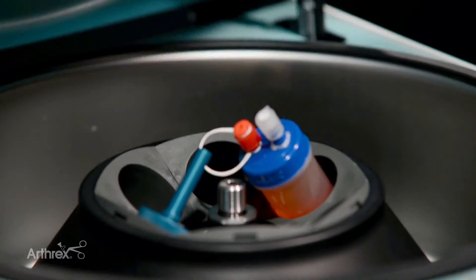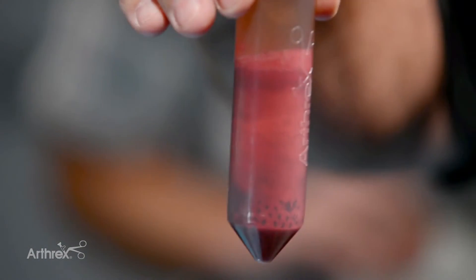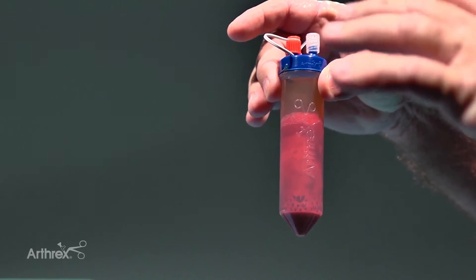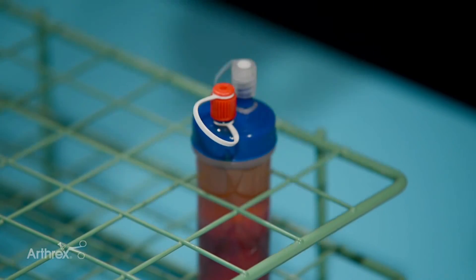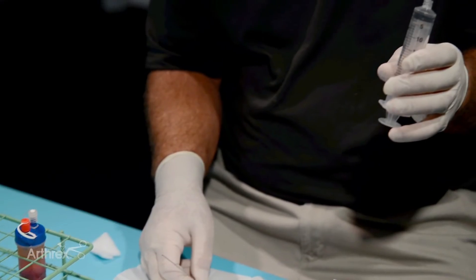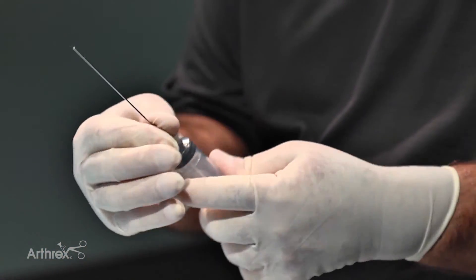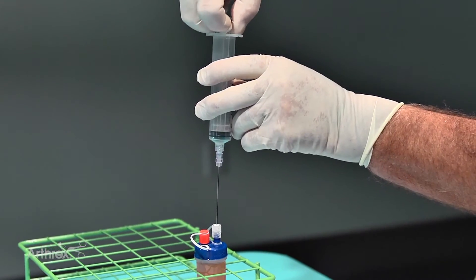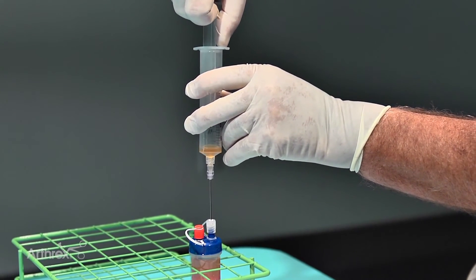After the 10 minutes we take our product out of the centrifuge. We'll be very careful not to shake it or invert it so that we don't interfere with the serum and red blood cell bed. Now we're going to harvest the serum. Make sure we alcohol the top. We get either a 20 or 30 ml syringe and a three and a half inch spinal needle, and go ahead and introduce the needle about an eighth of an inch from the red blood cell bed so we don't pull any red blood cells up.